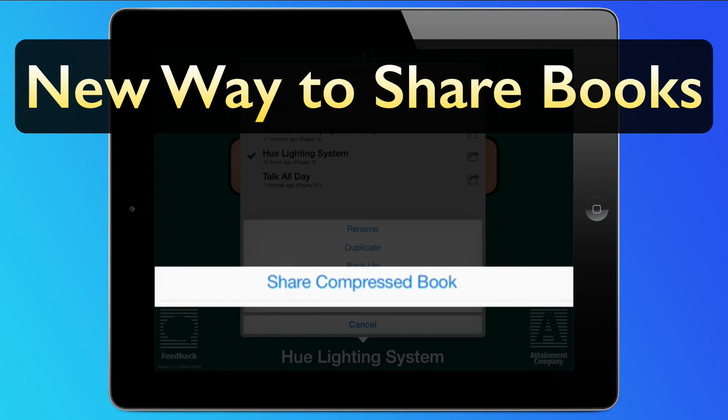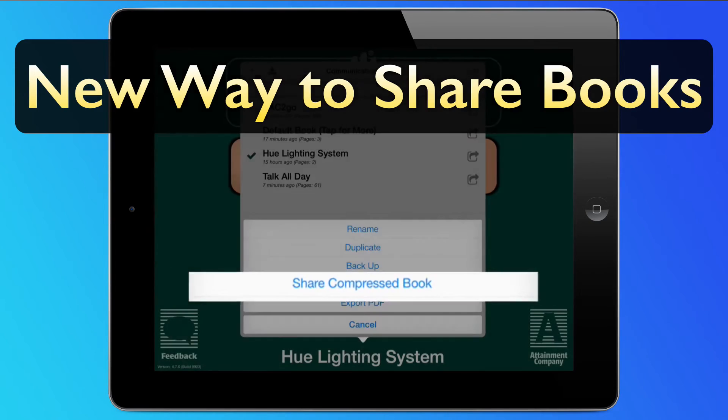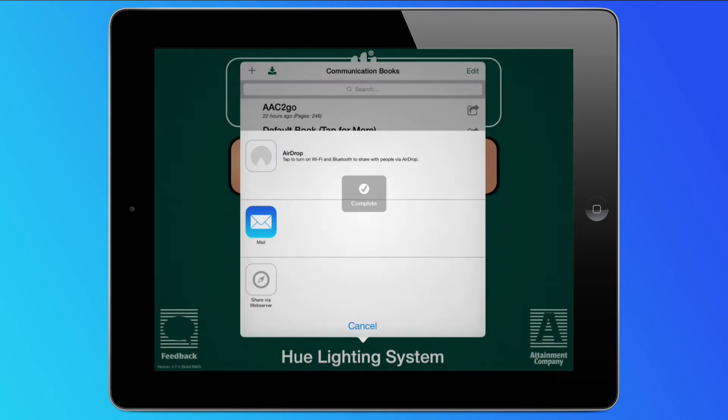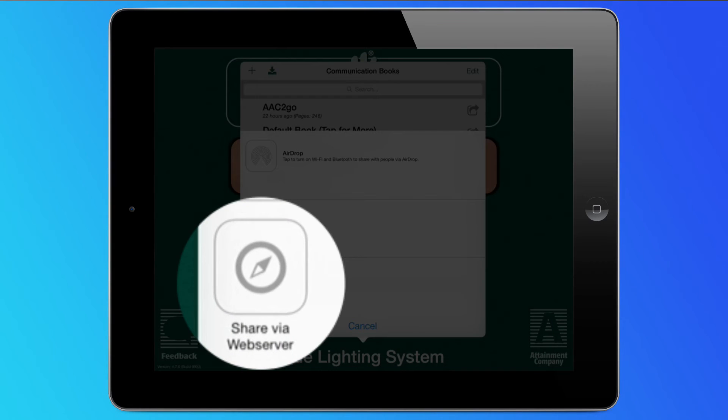And now we offer another way to share communication books. Simply follow on-screen instructions and use your local Wi-Fi network as a web server to upload and download books to your Mac or PC.